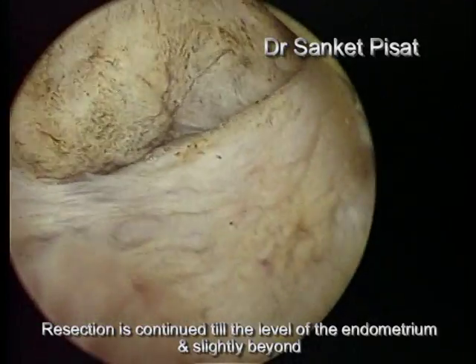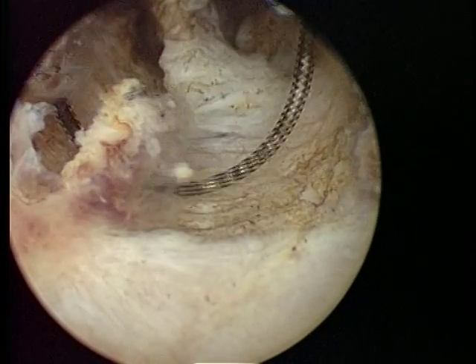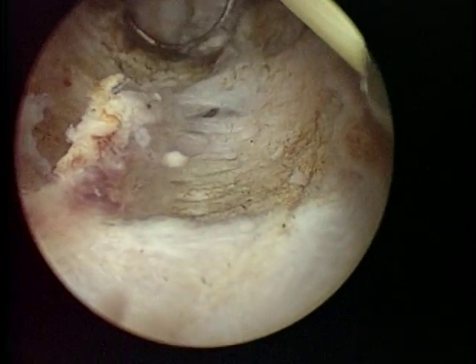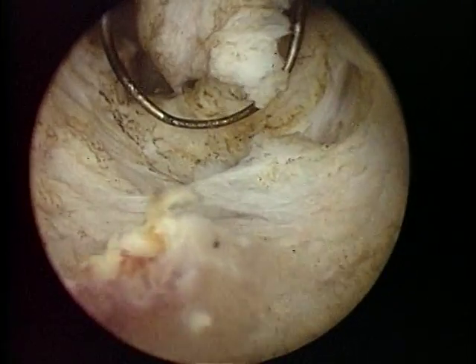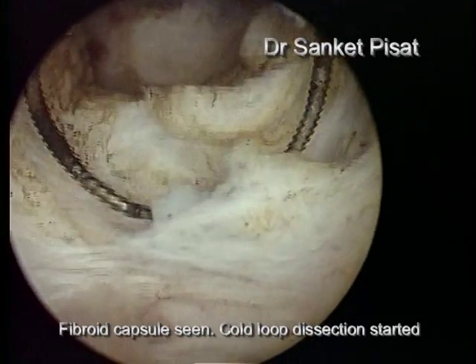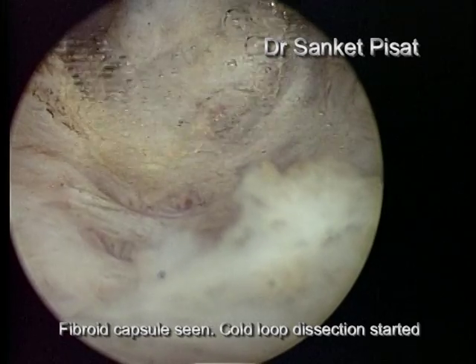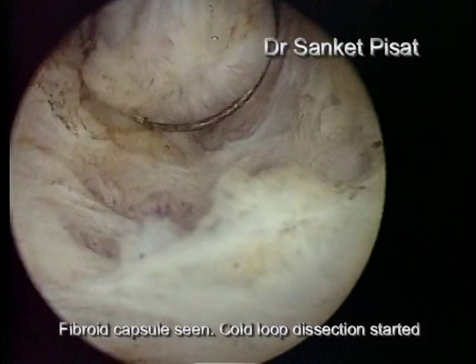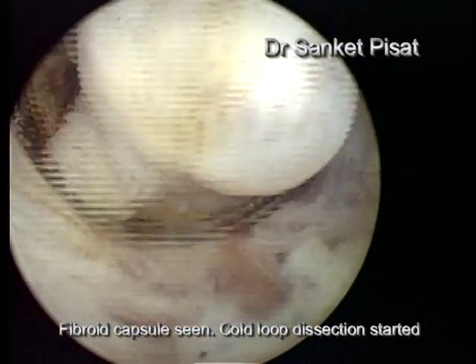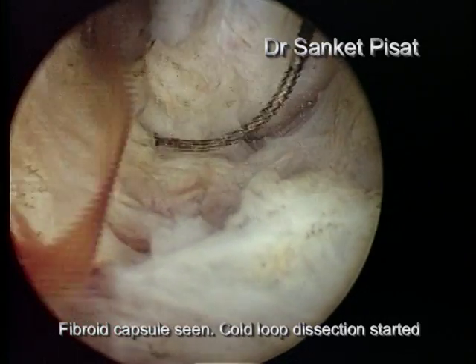However, after the first 2 or 3 cuts have been made, the surgeon reaches a point where he has to either dissect beyond the normal endometrial lining or stop the resection there, thereby leaving a part of the fibroid still attached to the uterus. It is at this stage that the surgeon dissects between the fibroid capsule and the normal myometrium using a cold loop, that is only mechanical force, only activating the electrode in short bursts of current to detach the myoma from its attachment to the myometrium.